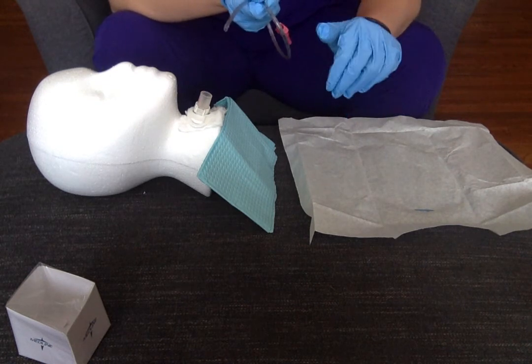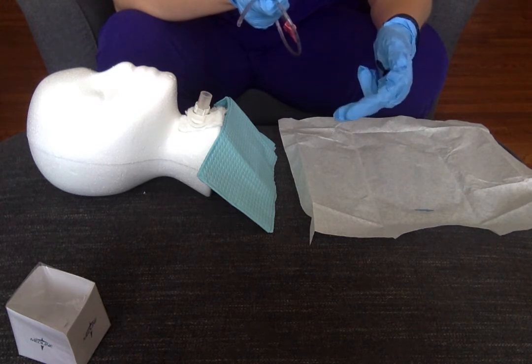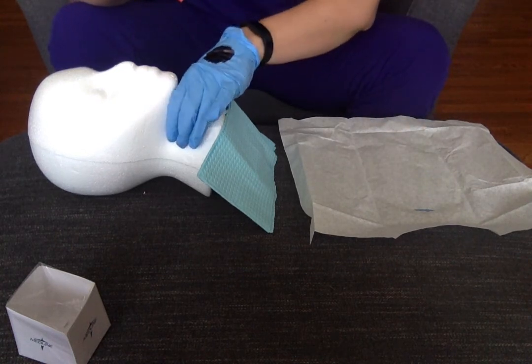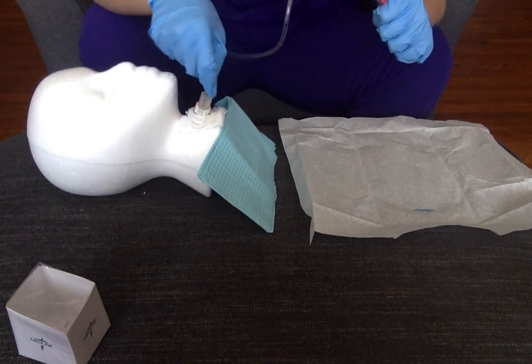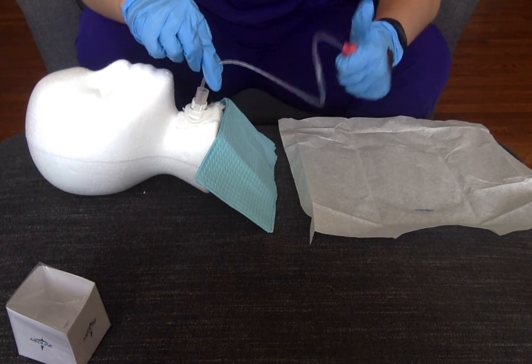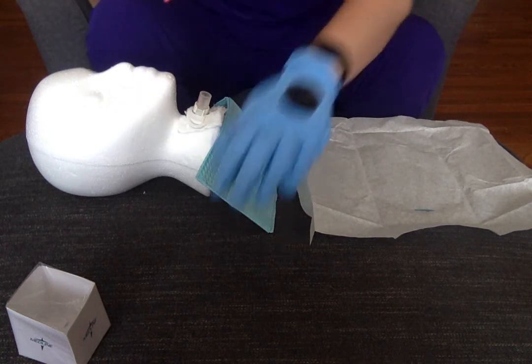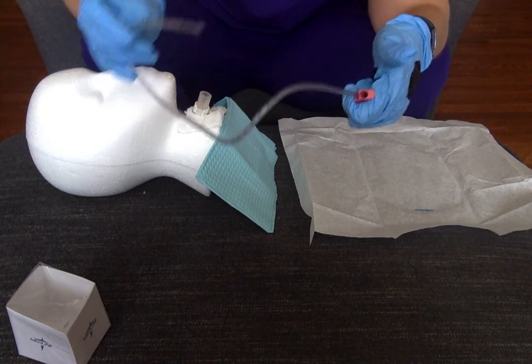We'll let them hyper-oxygenate for a minute. In the meantime, check if the patient has improved — has that rattling sound as they breathe decreased? Is their pulse oxygen level going up? Is their skin color getting pinker because they're oxygenating better? If they haven't improved enough, do another suction pass. After a minute, remove the trach collar again, get control of the valve, unwrap the catheter, and start feeding it back down. You know it's far enough when you hit resistance or the patient starts coughing — back it up half an inch, then tap intermittently on the suction valve while swirling the catheter out. Between passes, you can clean the catheter by dipping it in saline and tapping to clear secretions from the tubing for a better suction seal.